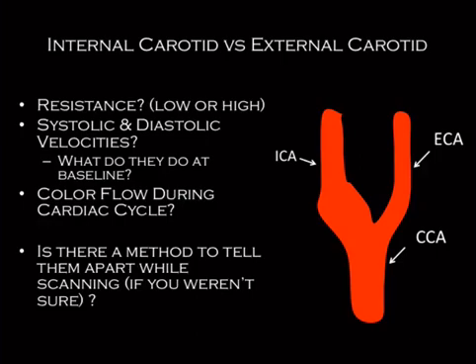The secondary thing is that external carotid has a whole bunch of branches. So if you were trying to tell the difference between the two of them while you're imaging, the one that's branching over and over and over again is the external carotid. And you may remember there's a mnemonic for that. Some administrators like fucking over poor medical students.